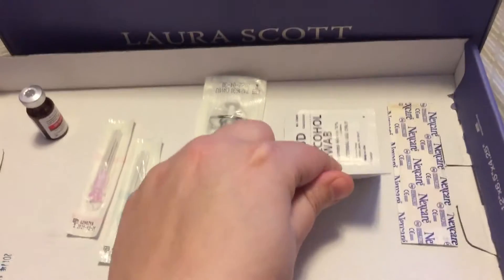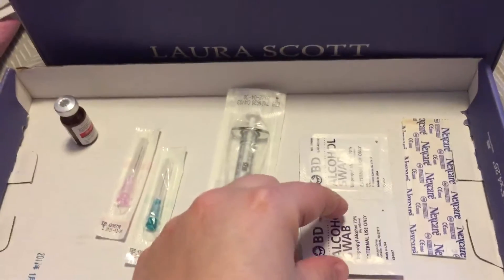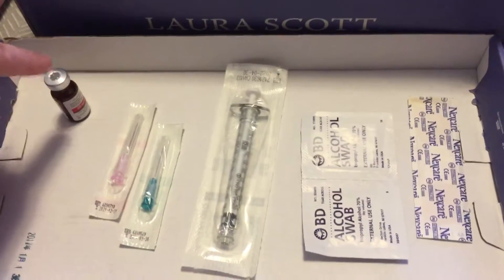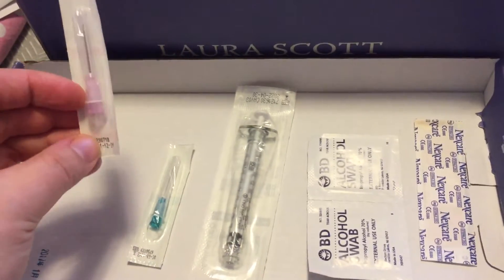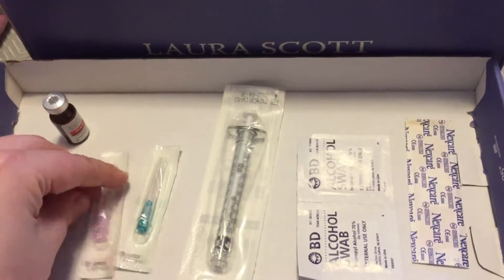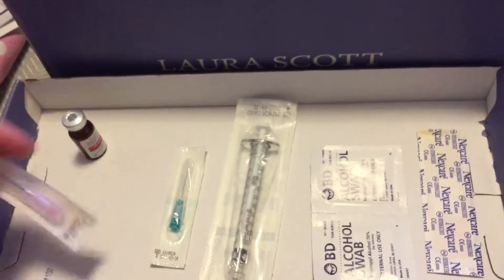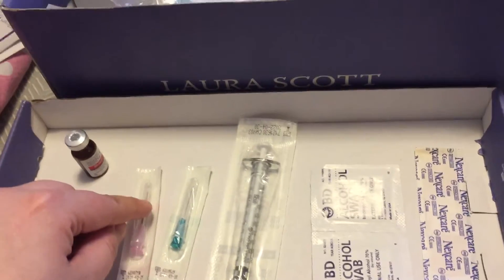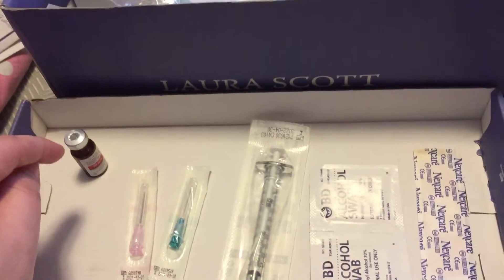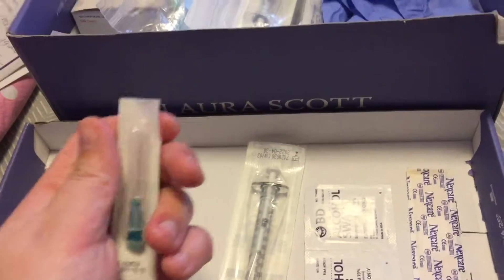First things first — I need to open this alcohol swab and wipe off my container. I'm not actually going to do all this on camera because I only have two hands, but I'll walk you through it. I swab this off, get it nice and clean, then open up this red needle. I've washed my hands so even though I'm not using gloves my hands are pretty clean, but I want to make sure I don't touch around this area or touch the needle itself. The needle comes with a little plastic cap so you don't have to worry about that as much. You screw it onto the syringe, draw up the medicine into the syringe from the bottle, tap out any bubbles, then switch to the smaller needle which also has a plastic cap on it.